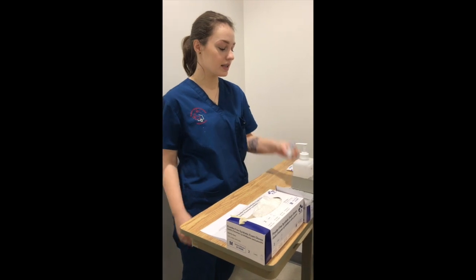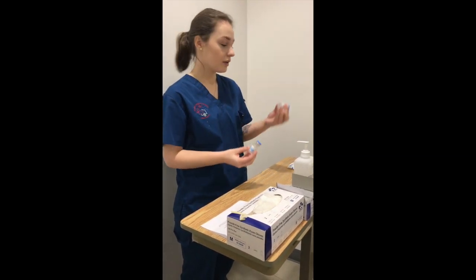So now we've gone to the dispensary and we've gotten out our 2 drugs. We have the heparin here, which is the dosage strength is 5,000 units per 1 milliliter, and our order from the physician is for 5,000 units. So therefore, we'll be drawing out 1 milliliter of fluid to inject into Mr. Mancini. We also have Haldol here. The dosage strength for this is 4 milligrams per 2 milliliters. And our order for Mr. Mancini is 1 milligram. So we'll be pulling out 1/2 milliliter of fluid to inject.